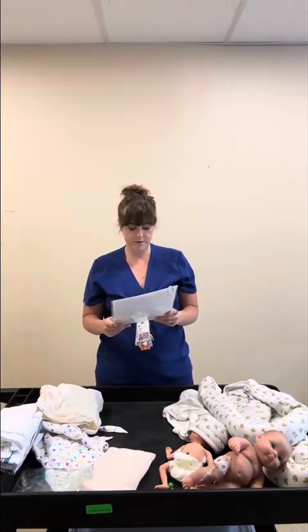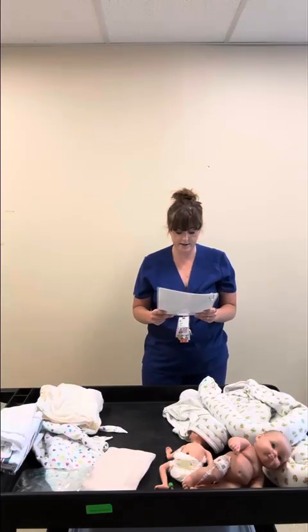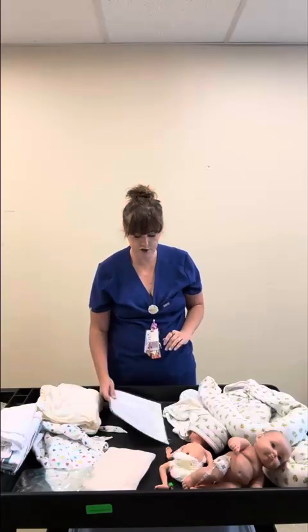Okay, last scenario. Thanks for bearing with me. Scenario number 3, you've got a 30-weeker, 1,300 grams in an isolette on bubble CPAP with an NG tube, full feeds. So positioning this patient prone.